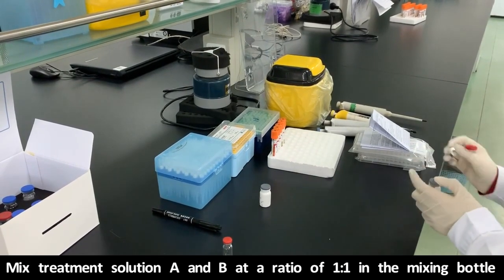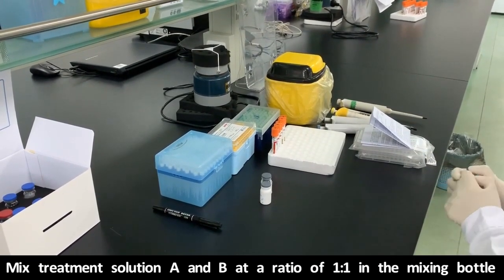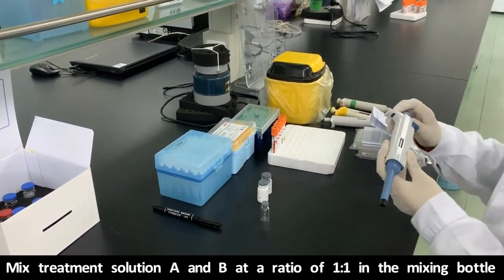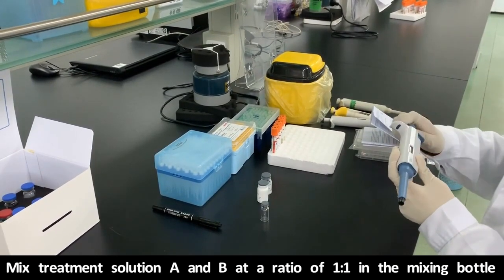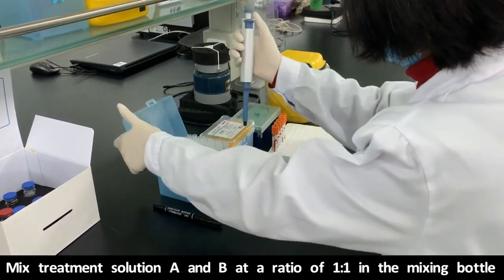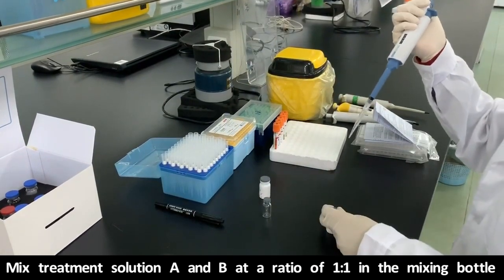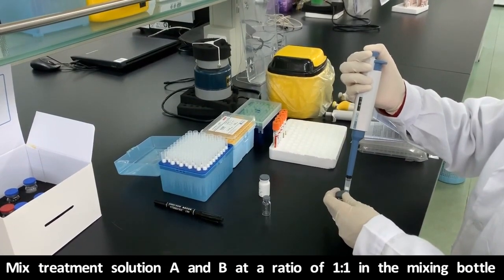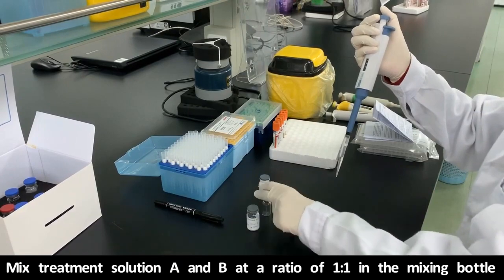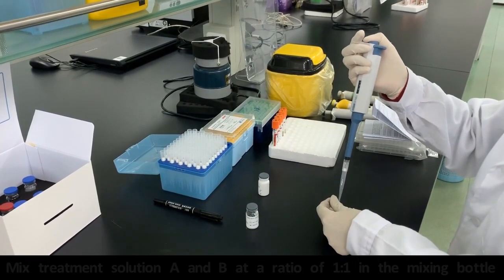these two solutions. It's important to mix solution A and B in a ratio of 1:1 in the mixing bottle. So use a pipette, which should be glucan-free and used for this purpose, and glucan-free tips, if you possibly can, to set this mix up. Remove the required amounts from solution A, place in the mixing bottle, and then do the same for solution B.